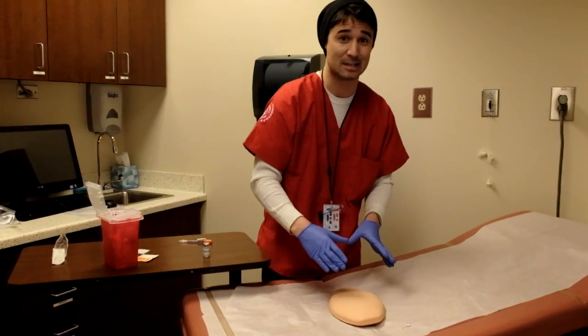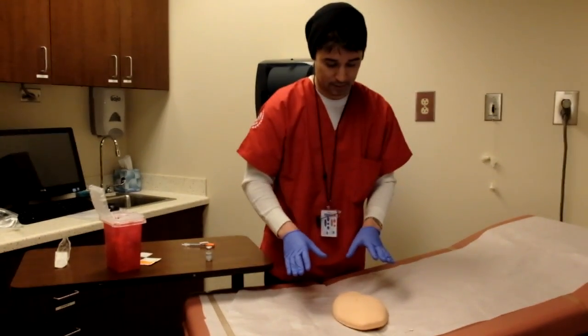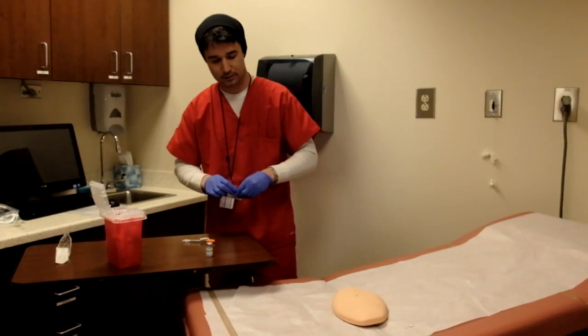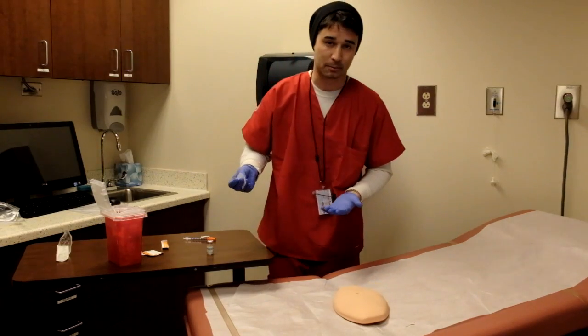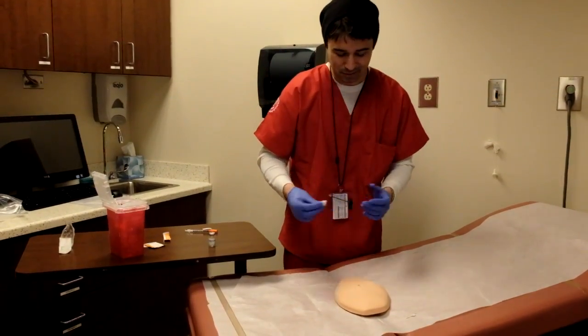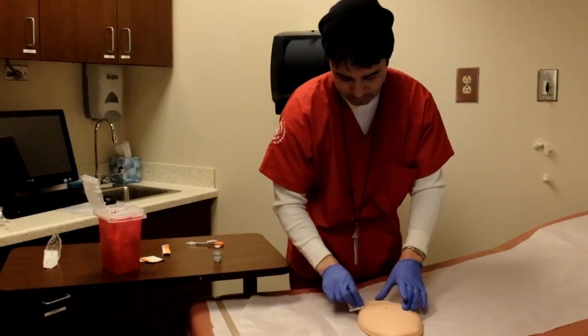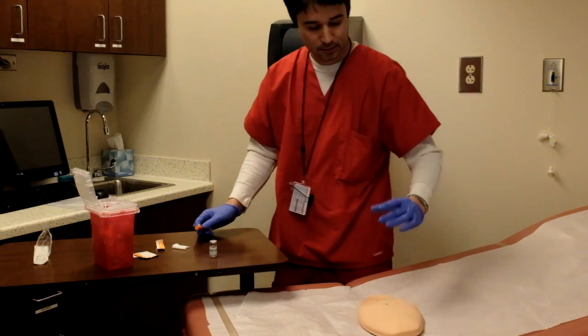We don't want to administer any medications into the belly button — it'll be a bad day. Once we've done that assessment, we're going to take our alcohol pad and clean the area that we're going to be injecting in. I'm just going to do a circular motion outward.